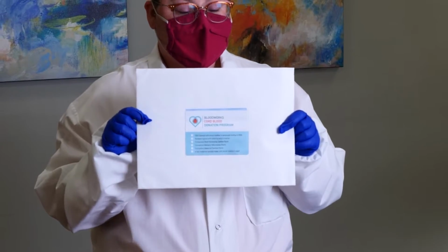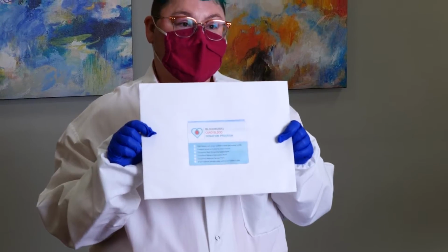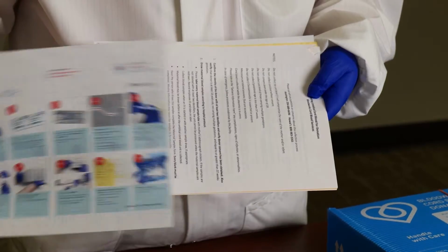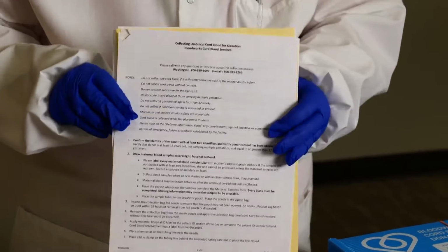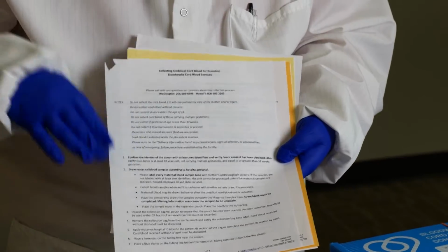This has all the information for the potential donor, as well as the forms that need to be filled out by the staff. Inside the admit packet, there is a collection guide in case you need a refresher on how to do the collection. There's also instructions in words if pictures are not quite your speed. These instructions include both the vaginal and cesarean deliveries.